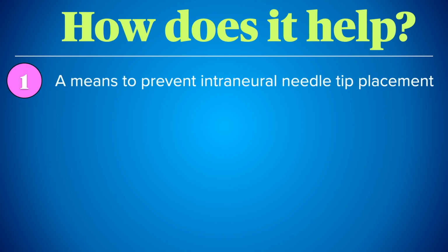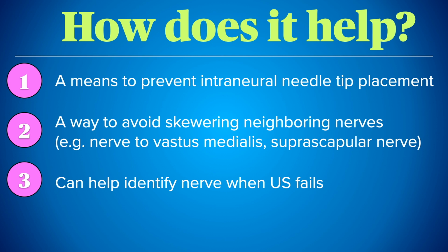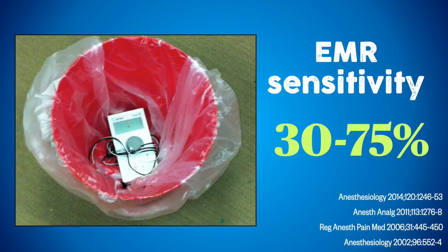Number 1, it can be used as a means to identify when the needle tip is too close to the nerve, and I'll get into more detail on that in a second. Number 2, it can be used to prevent direct needle trauma or nerve kebabs when the nerve lies directly in the path of the needle. Number 3, it's a way to help us when ultrasound can't help us, and we do have blocks like that, where the nerve just can't be seen with 100% reliability. And finally, I'll propose to you that it can be used to help us find the correct intermuscular fascial plane now and again.